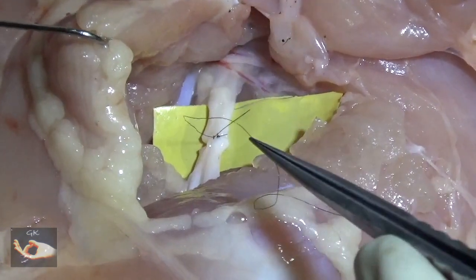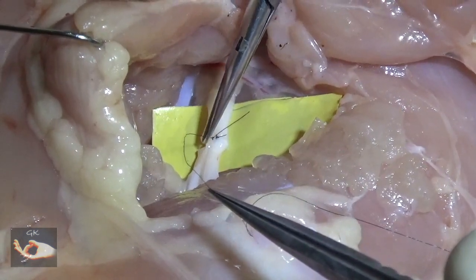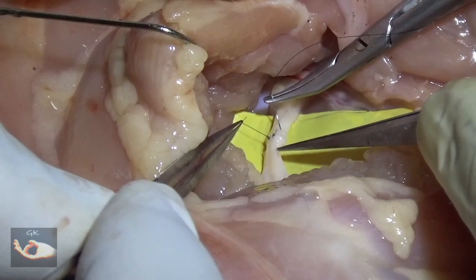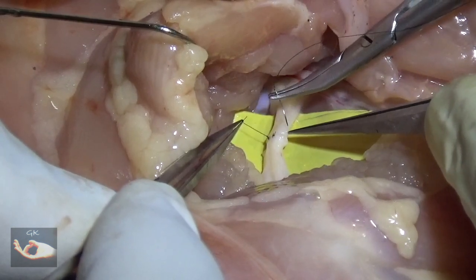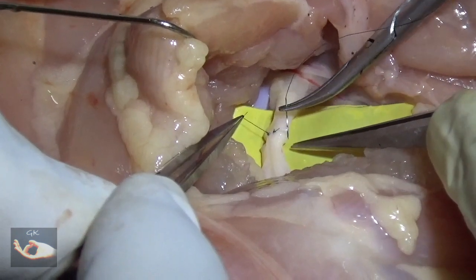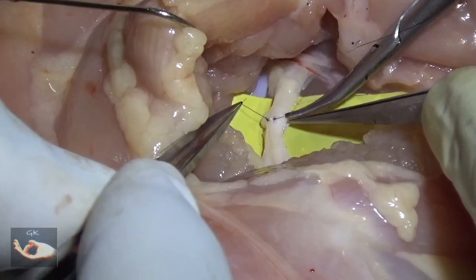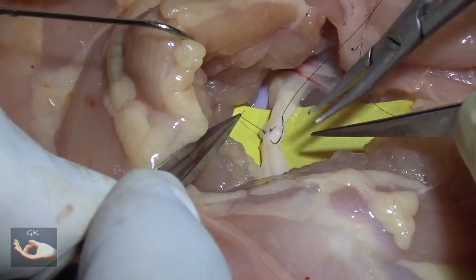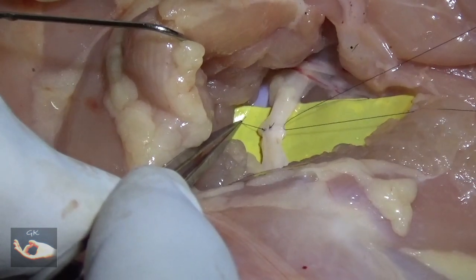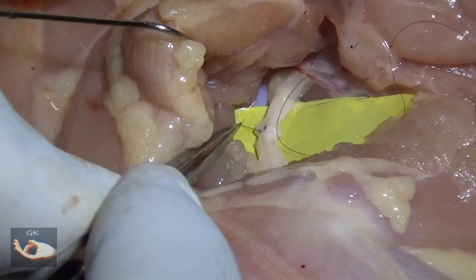You will note one problem in that the fascicles will tend to pout through the other ends that have still not been sutured. There are two ways of dealing with it. If it is a very minimal pouting, the epineurium over the pouting fascicle can be sutured, taking care to push the pouting fascicle inside. If the fascicle is too long, it needs to be trimmed. This trimming can be done before the epineural suturing or after the stitch is put in — if it is still pouting through, that pouting end can be cut and the stump pushed into the epineural repair.